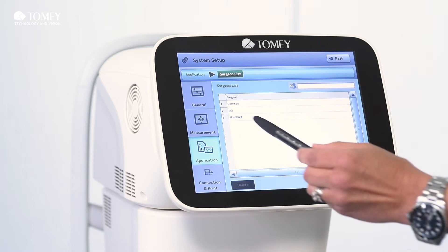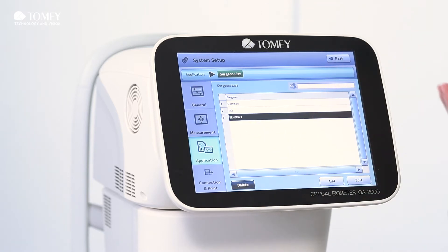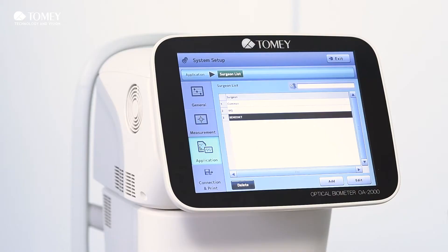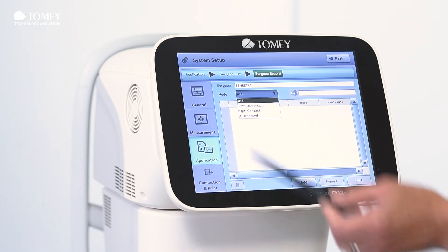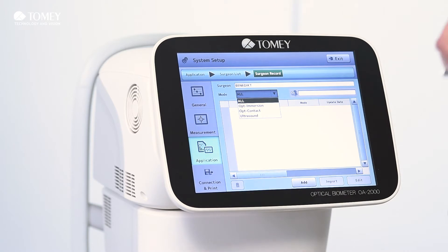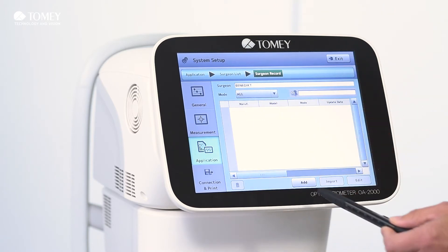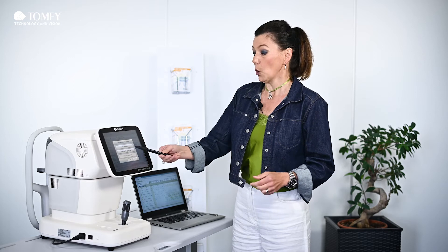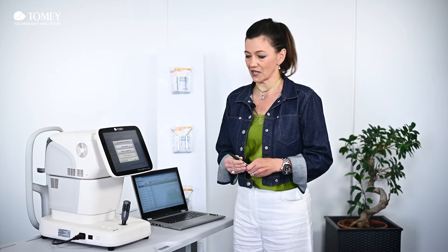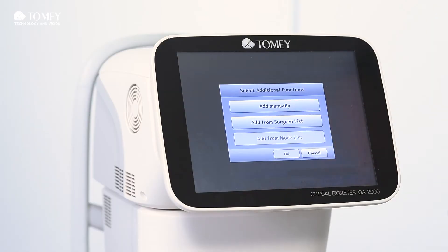In our surgeon list, for example, I added the surgeon name Benedict, and now we want to import the IOL data. You can do this by going on edit. Here you set the mode — immersion, contact mode, ultrasound — and then you can add data. You can add them either manually by typing everything in by hand, or if another surgeon has already imported some IOL data, you simply click "add from surgeon list" and import your favorite models.